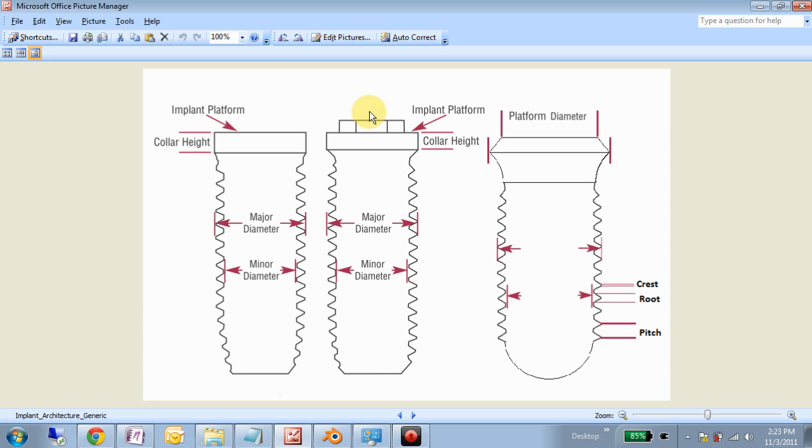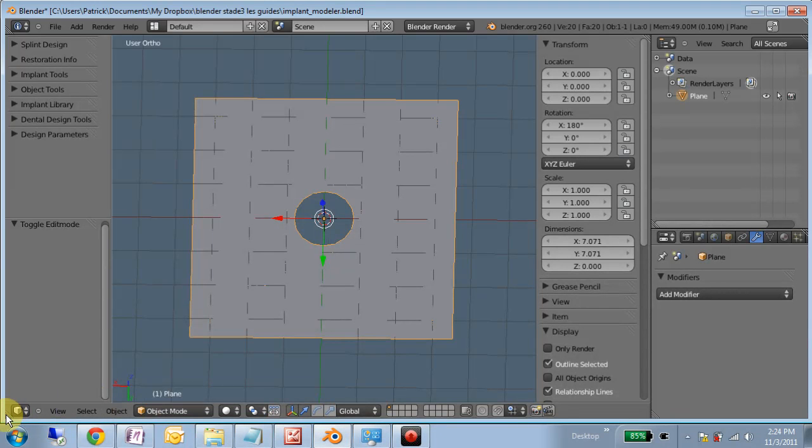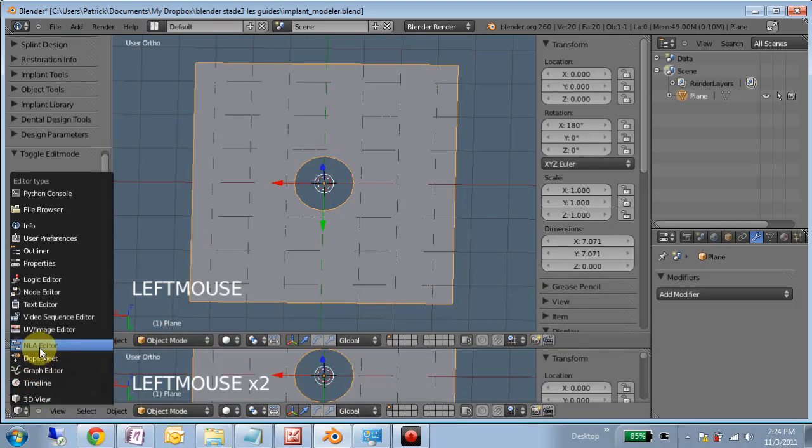You also want to know where the manufacturer is referencing in these heights. Is it from here to here, or from here to here, or even from the bottom of the collar to here? For the particular one I'm going to model, the height will be the platform height, top of the collar to the apex. So some things you might be interested in.